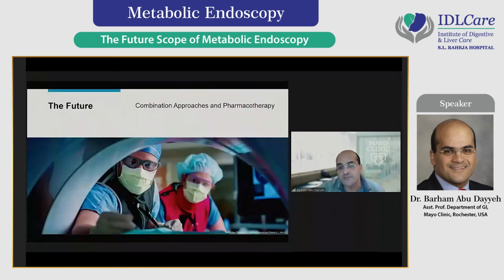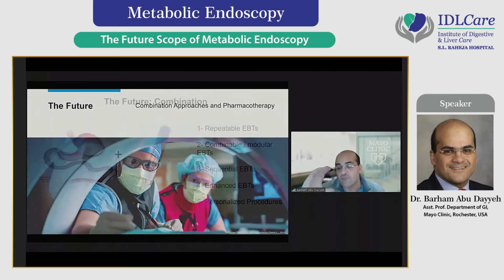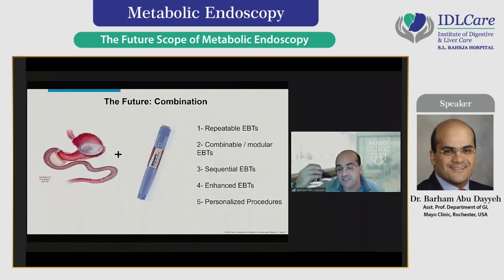So what's the future? The future is combination approaches with pharmacotherapy. We have now multiple effective devices targeting the stomach and small intestines. We also have multiple successful therapeutic agents like GLP-1 agonists. And now could we introduce them in sequence or together in order to have a paradigm for the chronic management of obesity? So repeatable devices, combinable devices, sequential devices based on understanding of the pathophysiology.